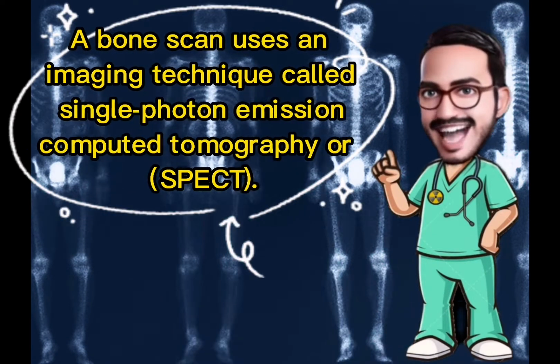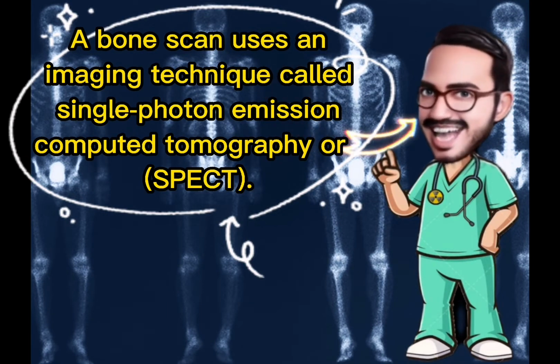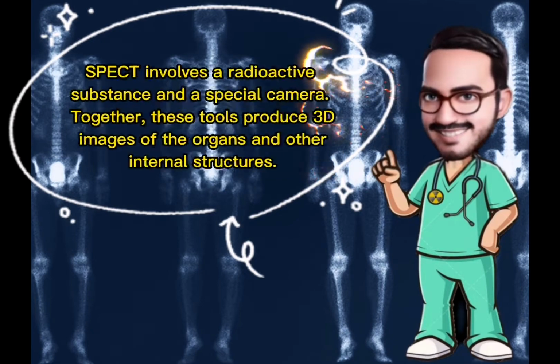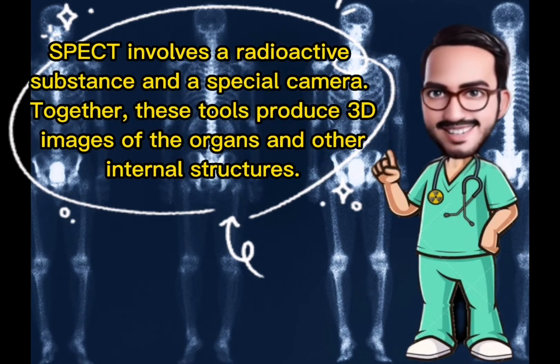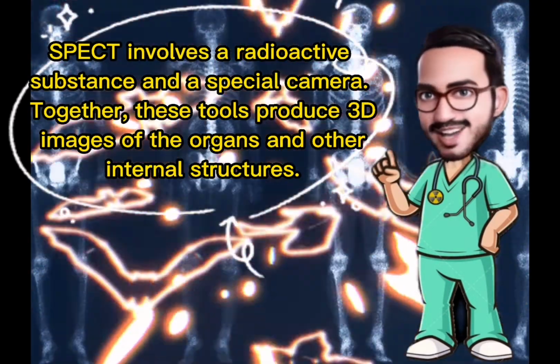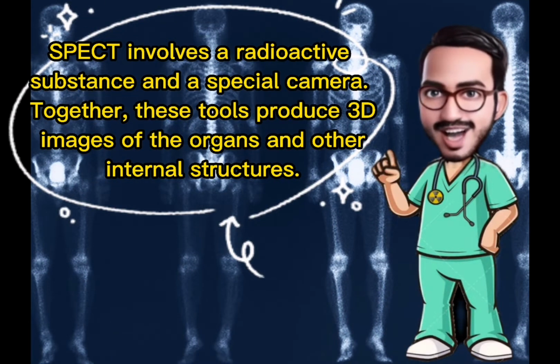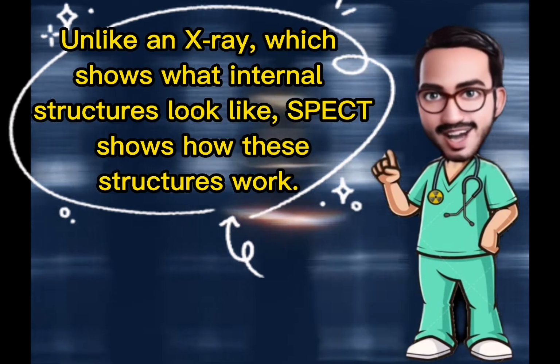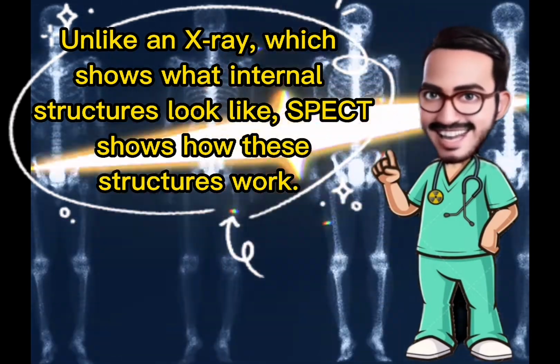A bone scan uses an imaging technique called single-photon emission computed tomography, or SPECT. SPECT involves a radioactive substance and a special camera. Together, these tools produce 3D images of the organs and other internal structures. Unlike an X-ray, which shows what internal structures look like, SPECT shows how these structures work.